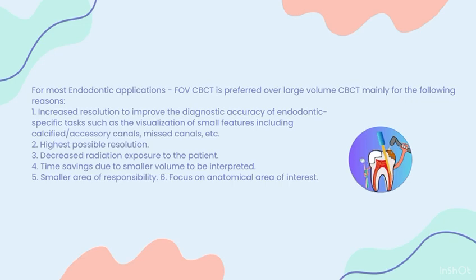Increased resolution to improve the diagnostic accuracy of endodontic specific tasks, such as the visualization of small features including calcified or accessory canals, missed canals, etc. High possible resolution, decreased radiation exposure to the patient, time saving due to smaller volume to be interpreted, smaller area of responsibility, and focus on the anatomical area of interest.